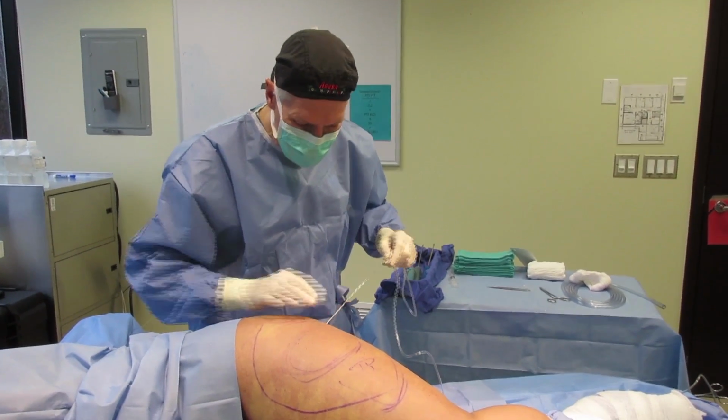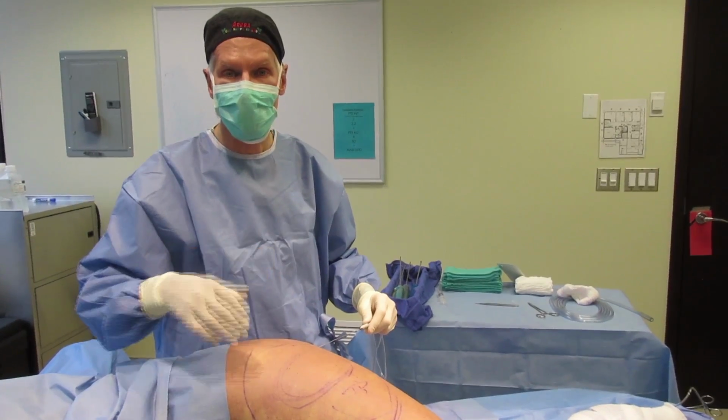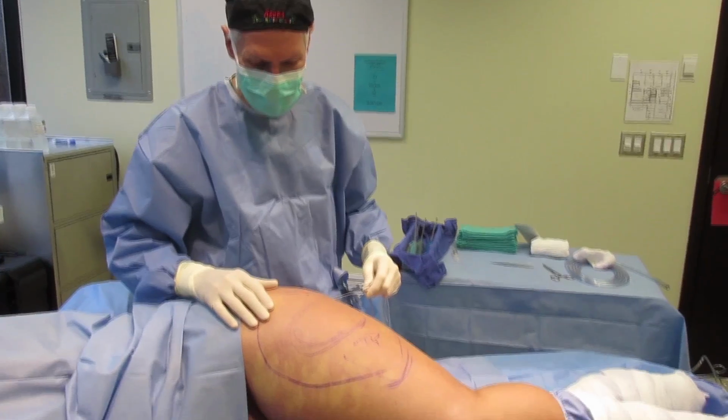And as I pass this underneath, and it's attached to a roller pump, I can put in a lot of local anesthetic, which is the lidocaine with epinephrine mix. I've done this now over half an hour ago, so this is all nice and numb now.